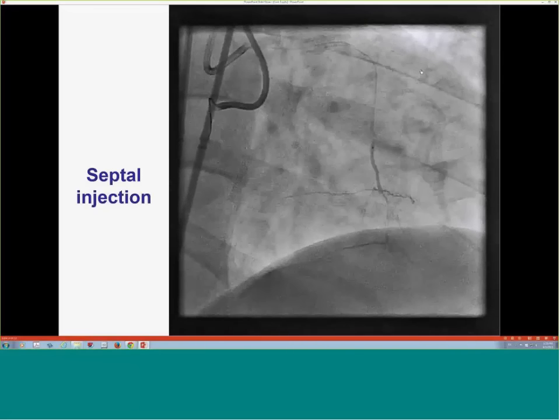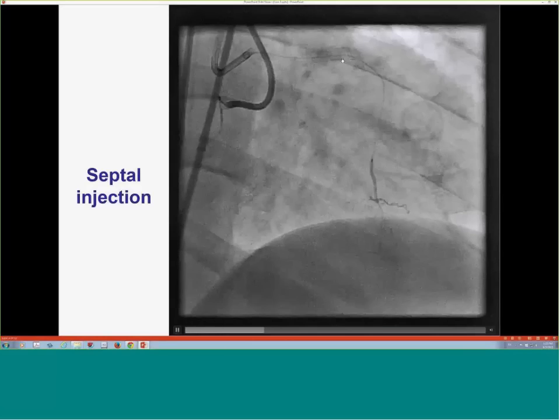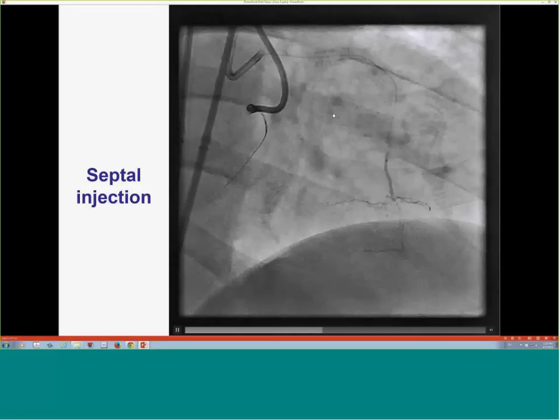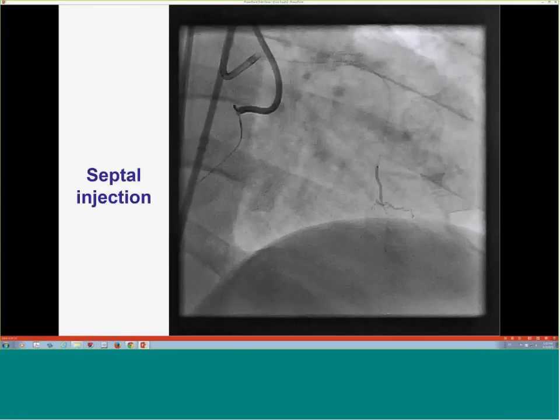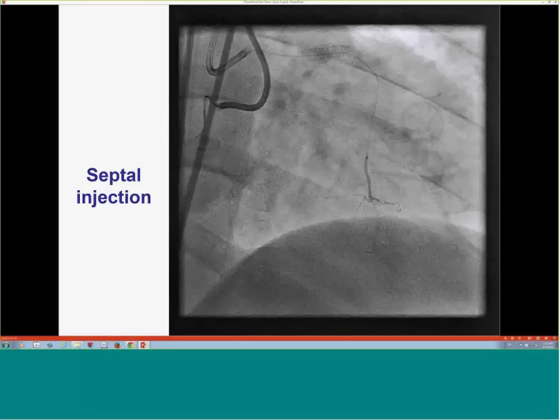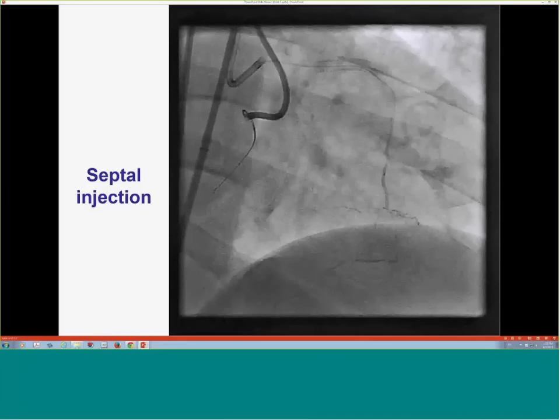You see there was an old stent in the LAD, but there was a septal further out from the LAD. We can go through stents, but sometimes you may have to dilate the struts to make it easier for the microcatheter to pass. And actually, this was the first case we did with a Micro 14, which is a new microcatheter by Roxwood, which has extra support, and it's a little longer than the current ones. It's 155 centimeters, so a little longer than before.